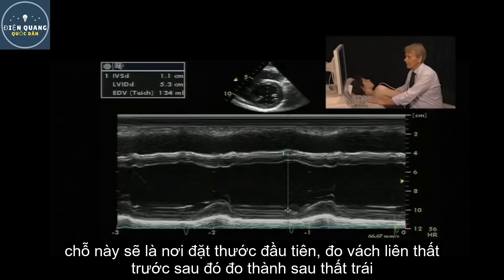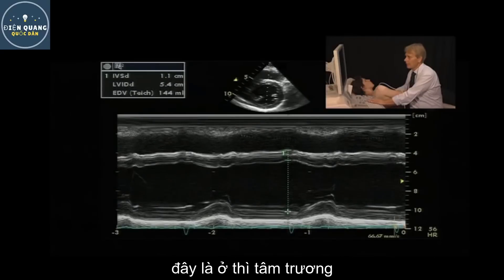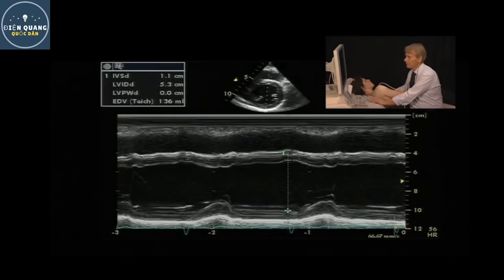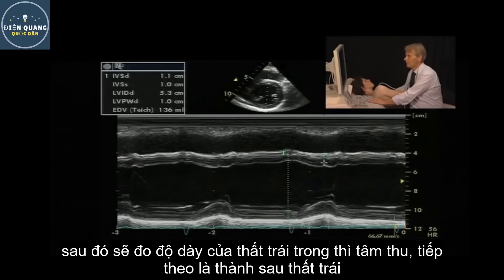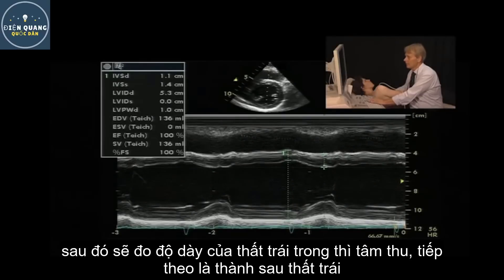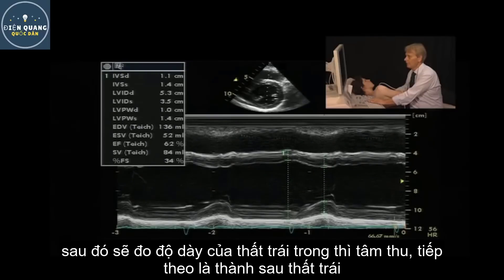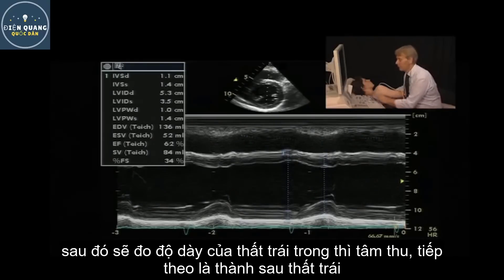Then you would measure the end-diastolic diameter and the posterior wall — all these measurements are at diastole. You would then perform the same measurements at systole: the end-systolic diameter and the posterolateral wall. These are basically the measurements that you would perform.